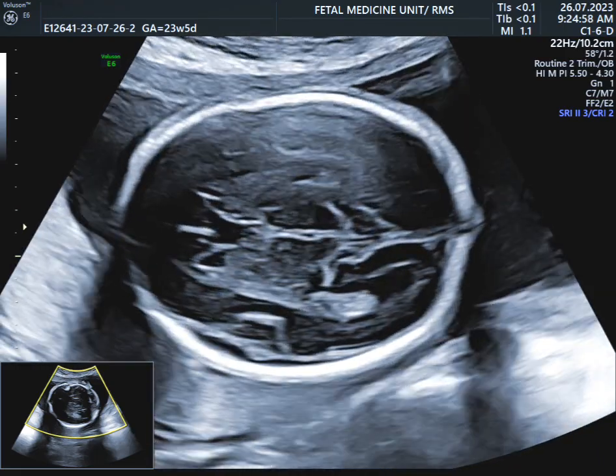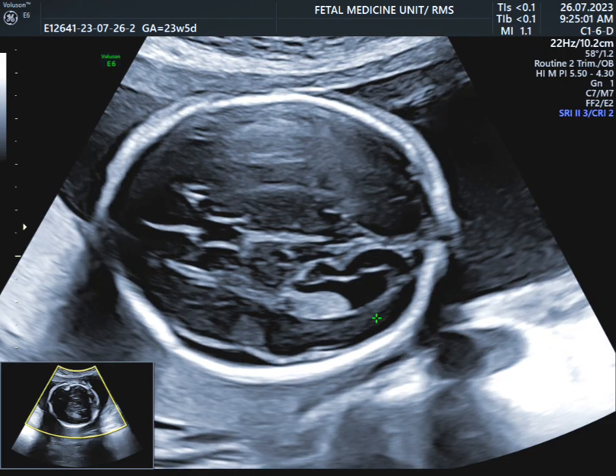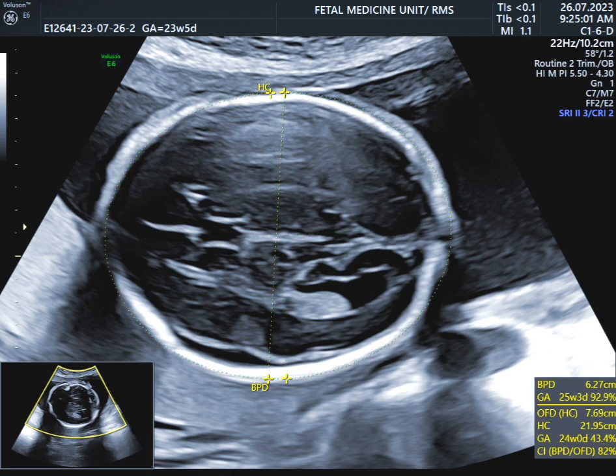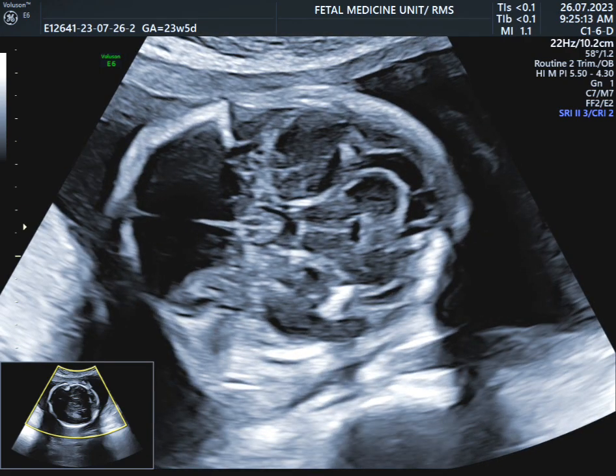Then we go to get the cavum septum pellucidum, and this is a ventricular view and outer to outer, the biparietal diameter. Then we get the head circumference. Then we get back to the cerebellum as we see the fourth ventricle. As we see, the cerebellum is intact.